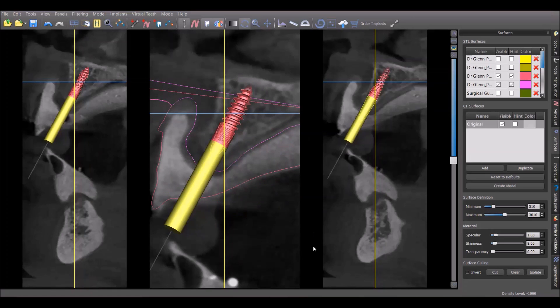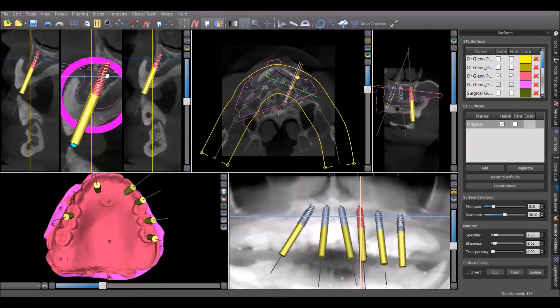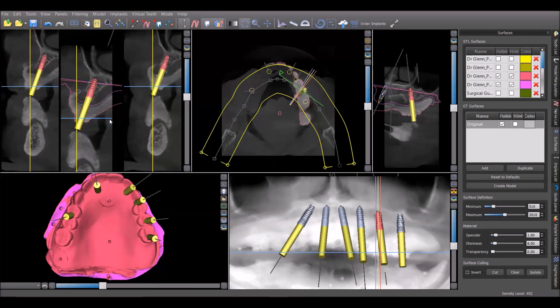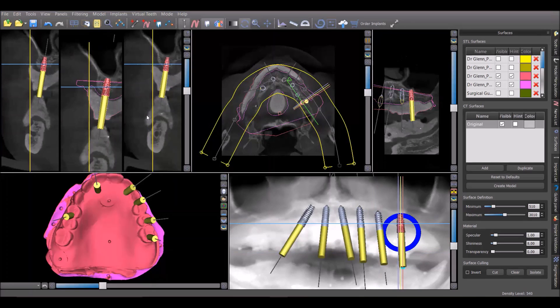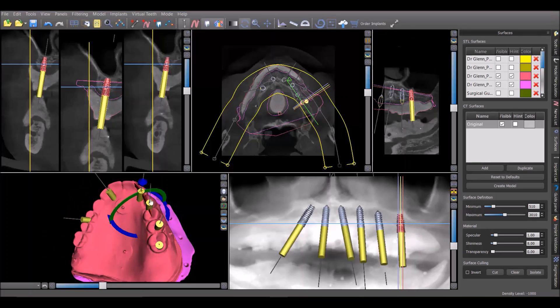Moving to the next implant, you can see a good amount of bone around it. Once we make the osteotomy, we'll be able to expand that and maintain bone on the buccal. The next site also shows plenty of bone. For the final implant, I'm planning a 4.3 by 6 millimeter implant to avoid the sinus — it's going to be right under the first molar site, and with all the implant support on this side, I have no concerns about doing that.